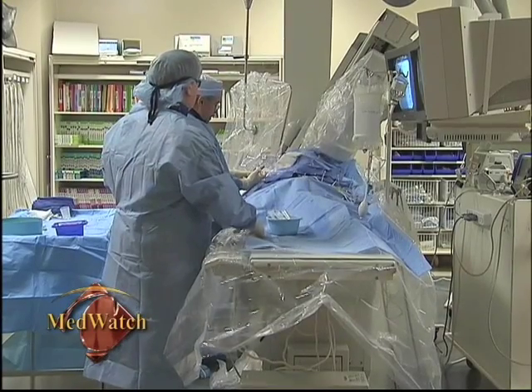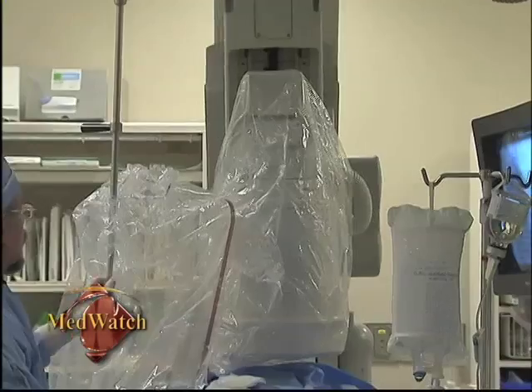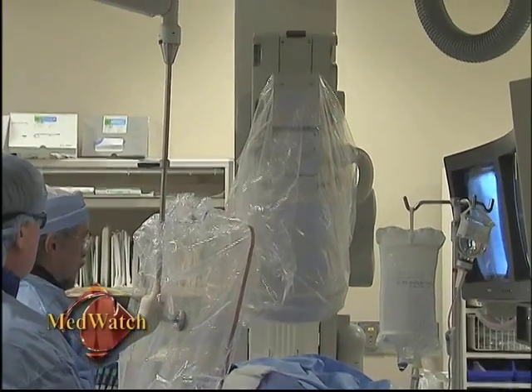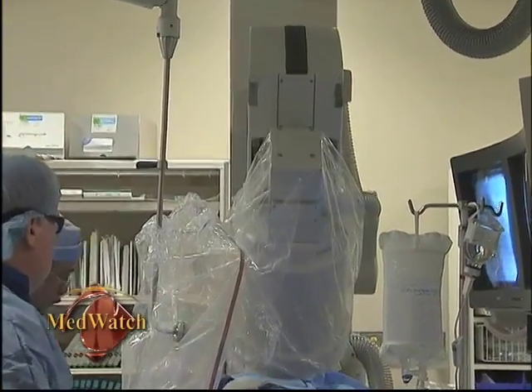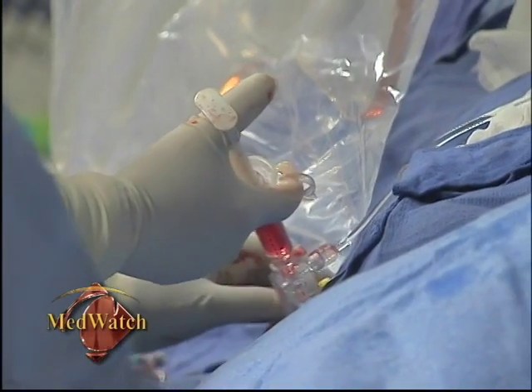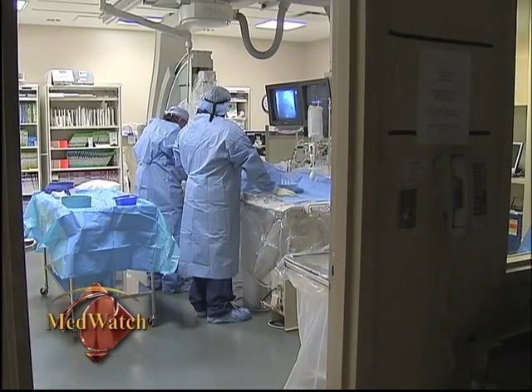Dr. Ambrose says only 1% of his patients experience pain when using the wrist as a point of entry. And according to a study in the British journal Heart, the transradial procedure reduces the need for blood transfusions by 50%. And we now recognize that bleeding complications of these procedures is a very important cause of morbidity, and actually occasionally patients can die from significant bleeding complications.